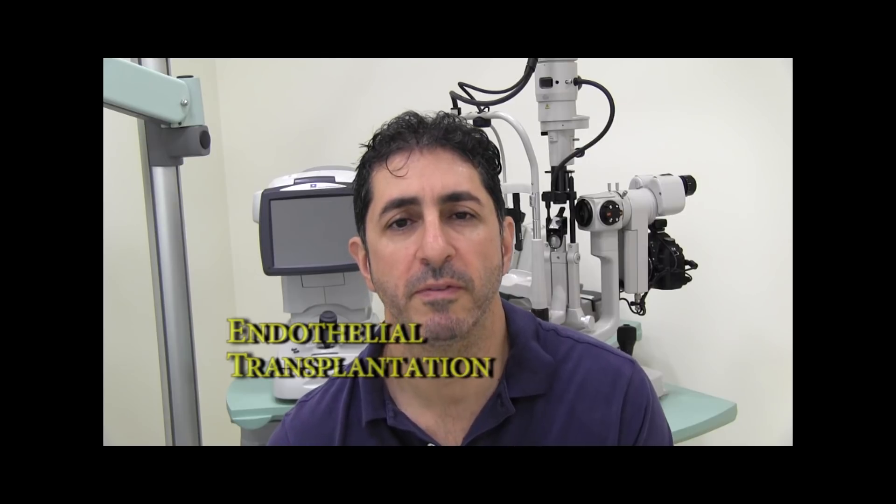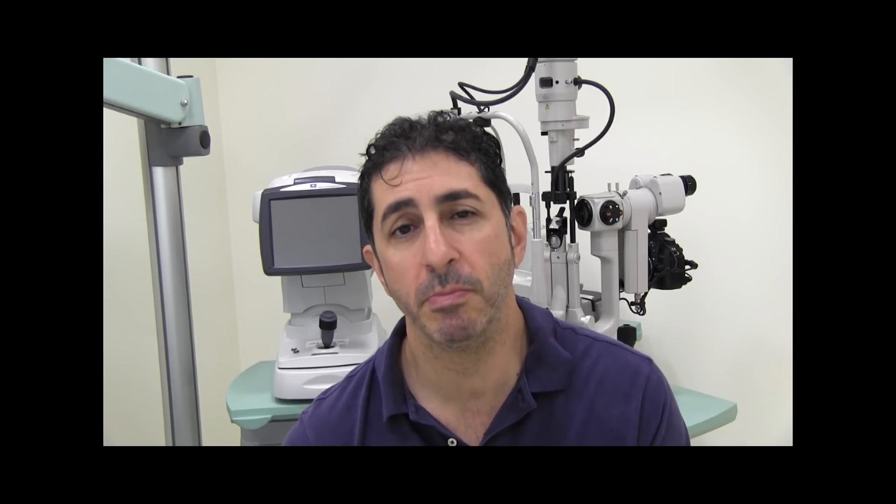Hi, I'm Dr Anthony Malouf of Eyes and Faces in Sydney, and welcome to another of my surgical video logs on endothelial transplantation. This is an exciting, revolutionary form of surgery that restores vision very rapidly in many cases. The aim of this video is not to give you an understanding of the minutiae of such a surgery or its evolution — it is simply to give you a better understanding to help you make that informed decision if you're ever told you need endothelial replacement surgery.